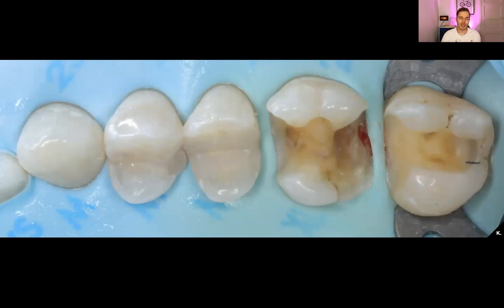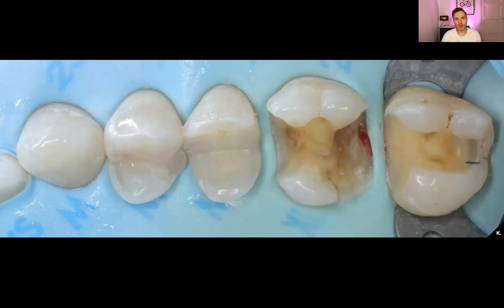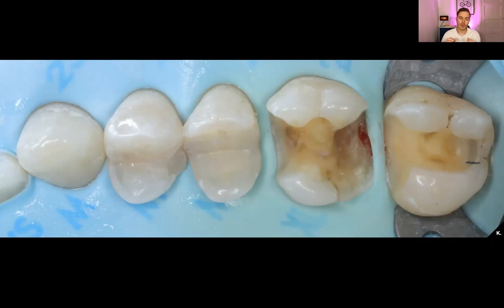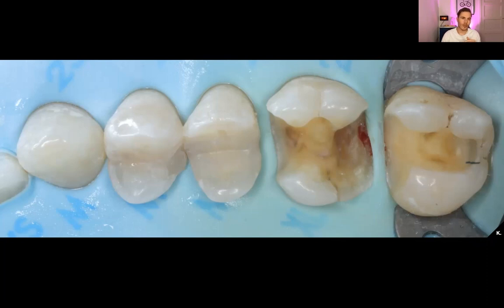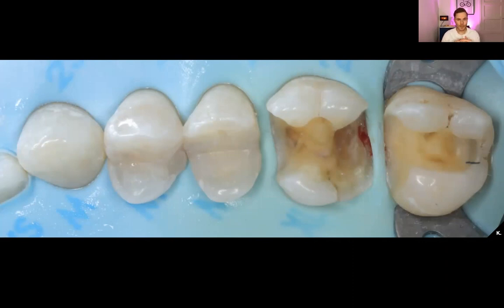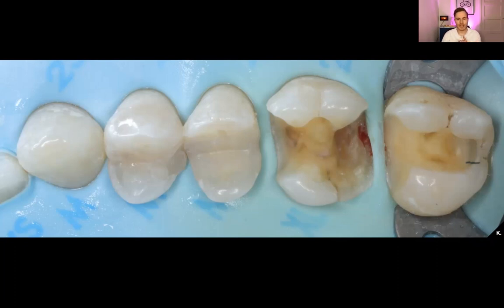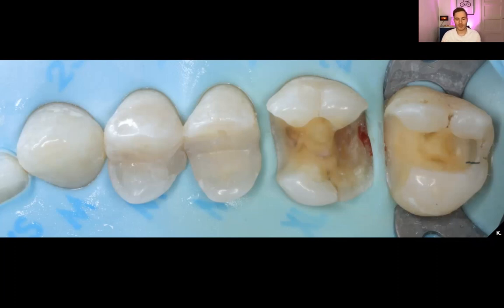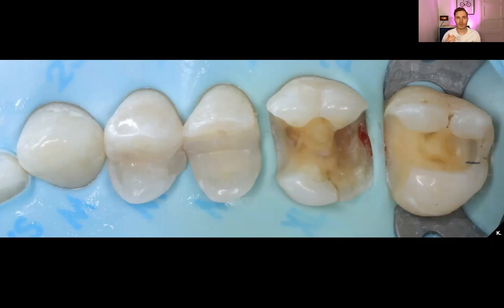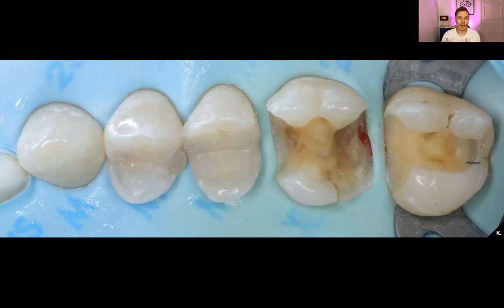To do a deep margin elevation — since these margins were too deep to restore directly — I decided to use a matrix-in-matrix technique. There's a new article by Pascal Magne that describes this technique. A deep margin elevation, or cervical margin relocation, or box elevation, is essentially applying a little bit of composite to raise the outline of your preparation, making it easier to take impressions, easier to isolate, and therefore easier to cement the final restoration. In most cases you don't need more than one to three millimeters, because you can always use additional tricks with your isolation or impression taking.